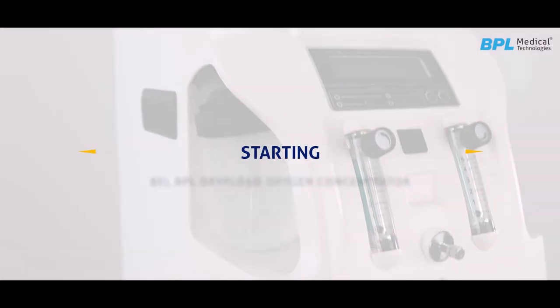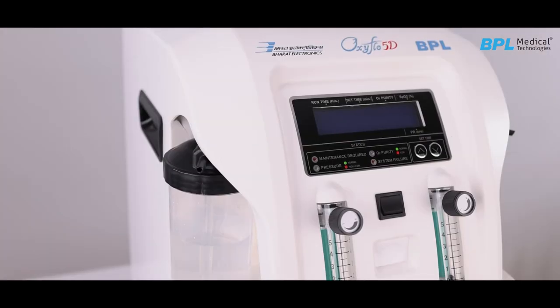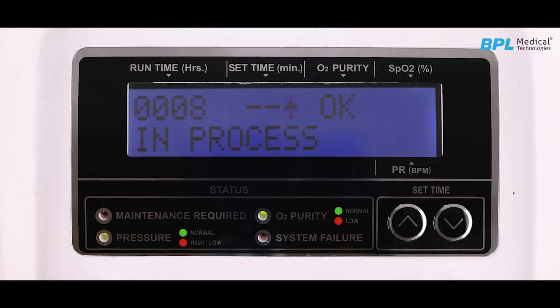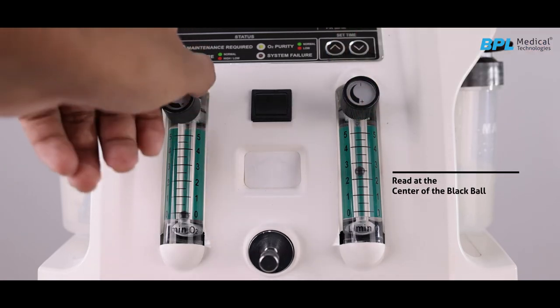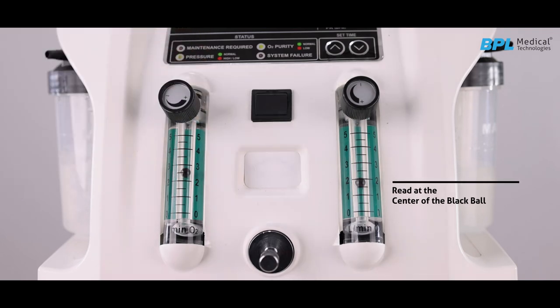To start the oxygen concentrator, insert the power cord plug into the electrical outlet. Set the power switch to the ON position. The display will be initialized and a welcome BEL-BPL message will flash. The machine will start performing self-tests with status messages flashing on the LCD. After completion of warm-up, the machine will display 'in process' along with other timers and status messages. To set the desired flow rate of supplemental oxygen, turn the flow meter adjustment knob until the ball inside the flow meter centers on the flow line number prescribed by the physician. The concentrator is now ready for use.